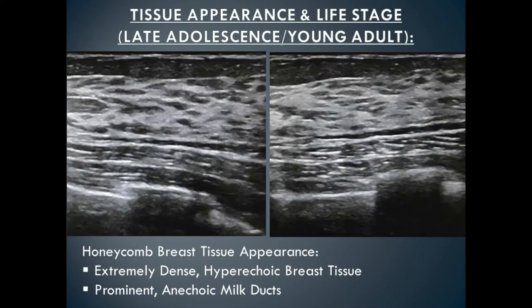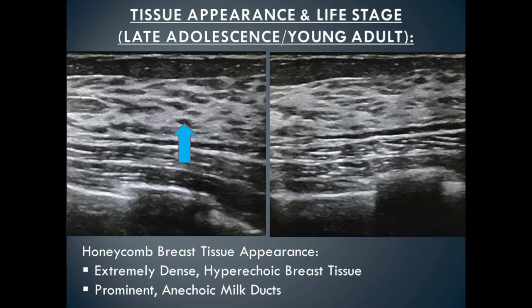In the next stage of development, during late adolescence and young adulthood, the tissue has an appearance called the honeycomb appearance. It's called this because the white glandular tissue against the little black lines forming the milk ducts makes it look like a honeycomb. The tissue pattern during this stage tends to be very dense, and because that dense tissue is white on ultrasound, it's easy to see the anechoic milk ducts against it.